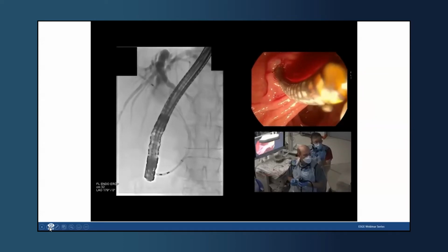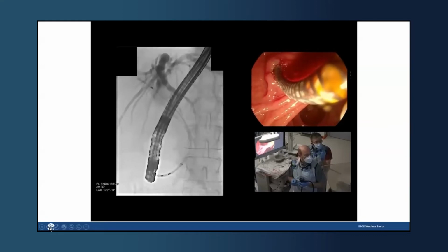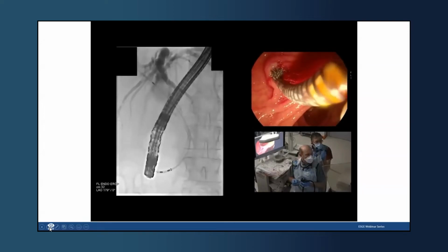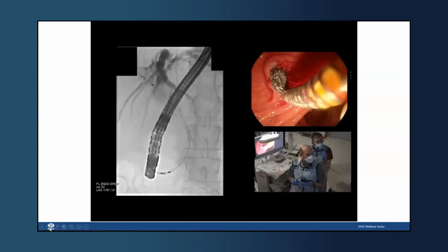Okay, pin out. Yeah, don't come back too much now. You're okay. Yeah, very nice. Beautiful, very nice, well done.